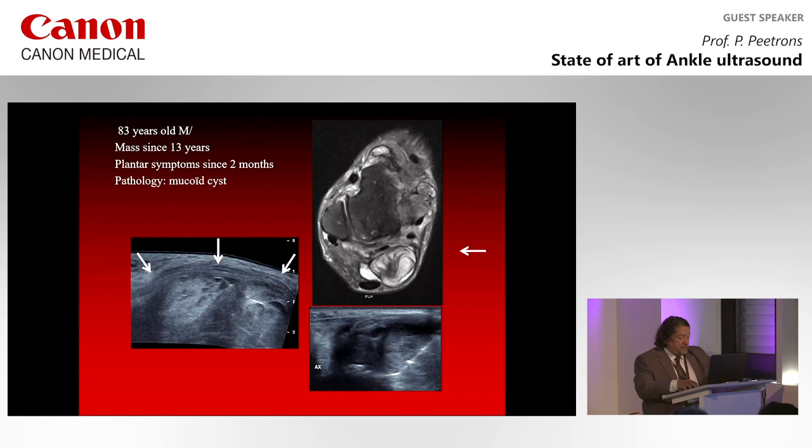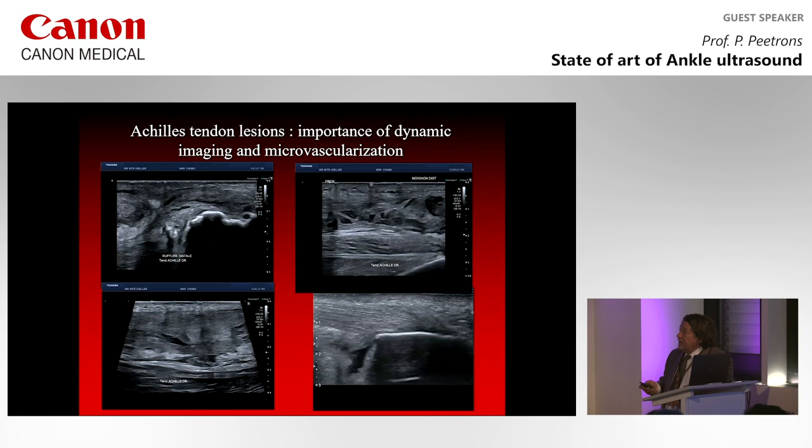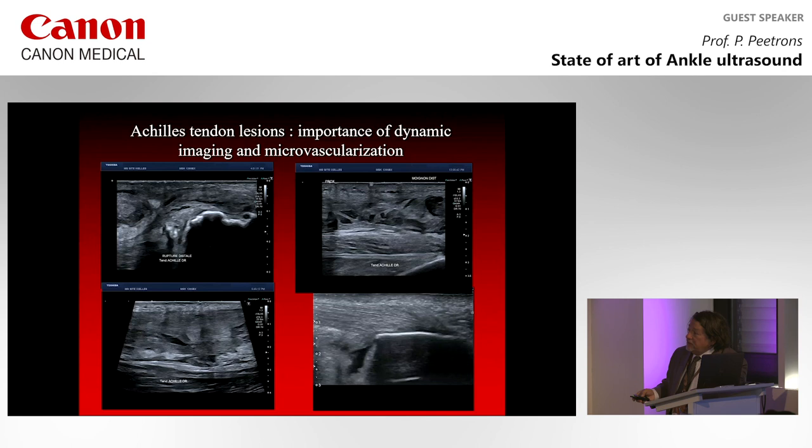It's now 45. And I'll show you what is also important to do when you have a tendon lesion. You have dynamic imaging and microvascularization imaging. Dynamic imaging tells you what happens in these four Achilles tendons. In this tendon, you see a little liquid between the calcaneus bone and something. You see a gap in the calcaneus bone. In this one, you see liquid and holes in the Achilles tendon. Here, you see liquid and holes in the Achilles tendon. And here, you see liquid in the retrocalcaneal bursa.